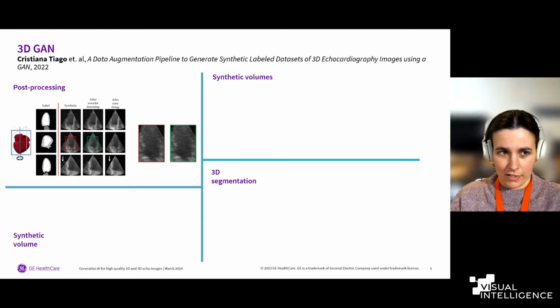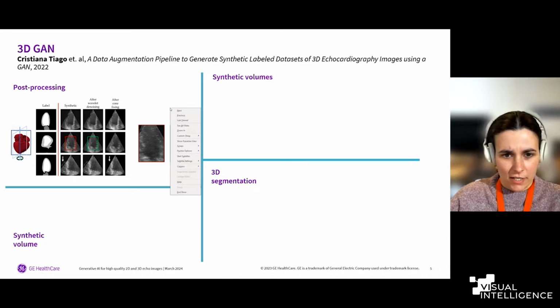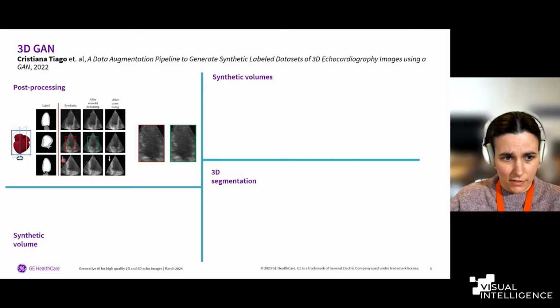And after we accounted for that, we saw that the images that were being synthesized still needed some kind of post-processing operations, mainly regarding the cone shape. For example, you see here at the bottom, we had to remove some extra areas which were sampled for some reason by the model. So we had to perform this post-processing operation to give the cone a certain shape.